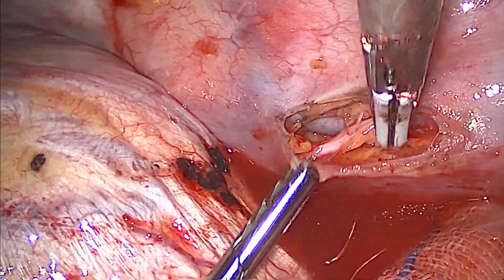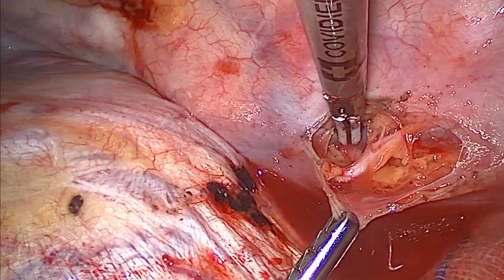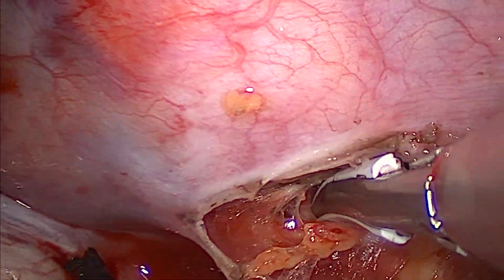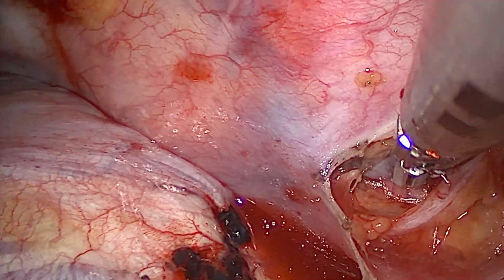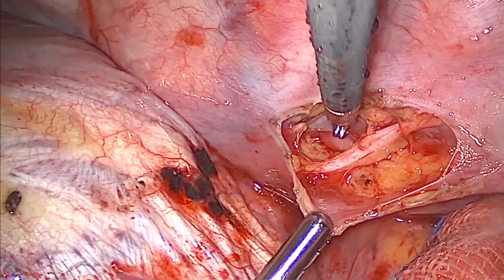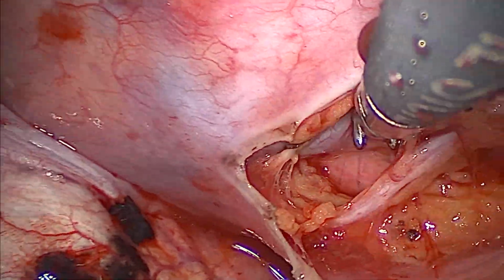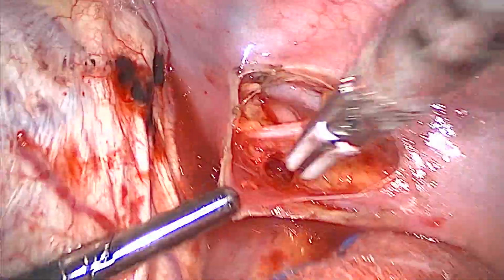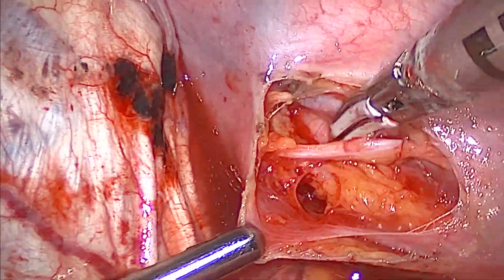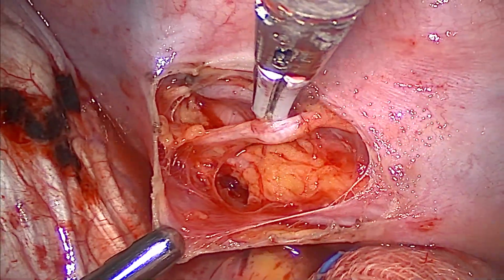You can see the azygos vein at the back, and a branch of the thoracic duct has started to appear anteriorly, and we continued careful dissection to find the main thoracic duct. My practice usually is that once I have seen the thoracic duct, I tend to divide it just to see the gush of chyle coming out, which usually confirms that this is the main thoracic duct.